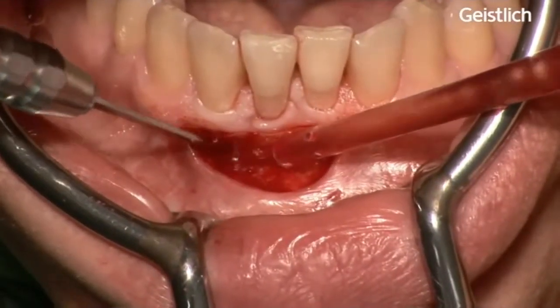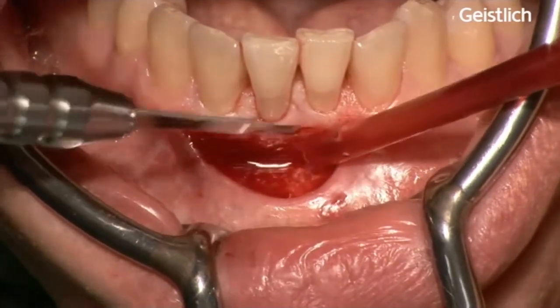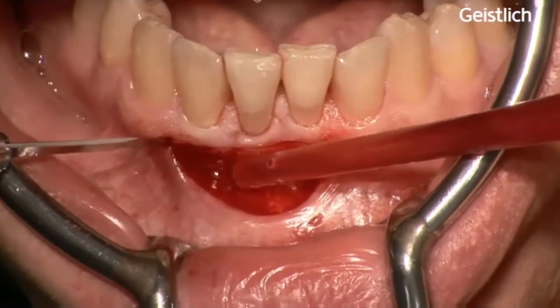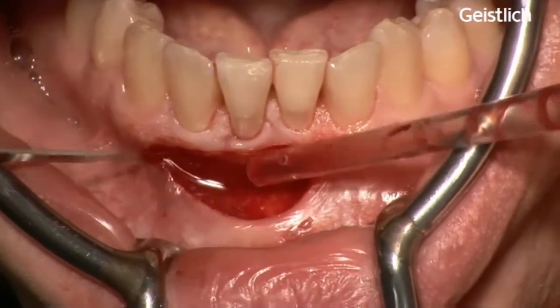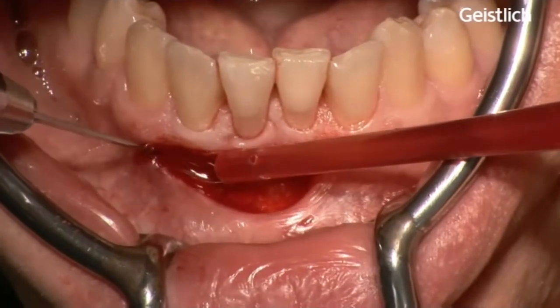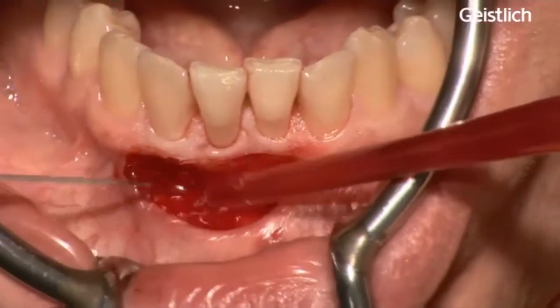In the area where we want a gain of keratinized tissue, an intact periosteum needs to be maintained to protect the underlying bone in the recipient bed for better healing of mucograft matrix when positioned later on.